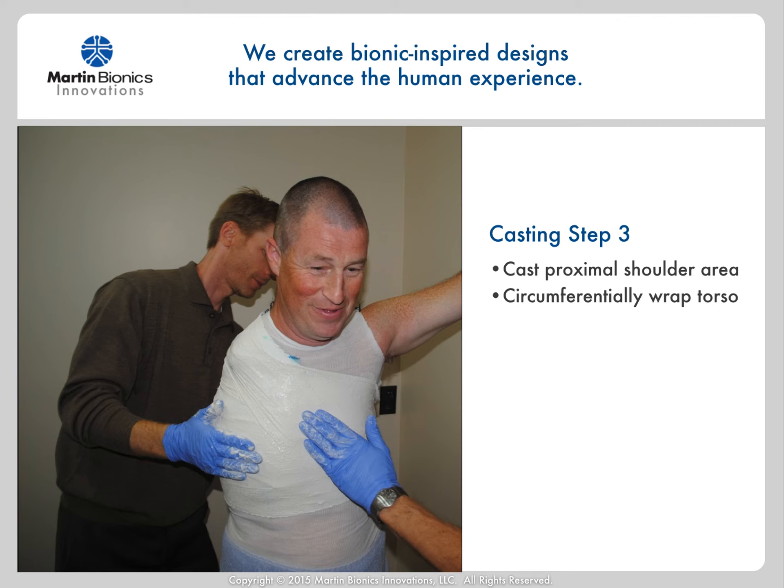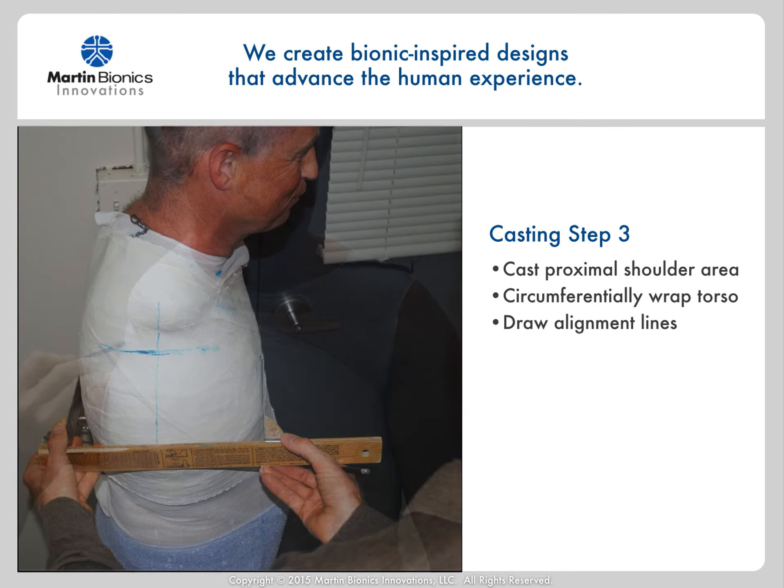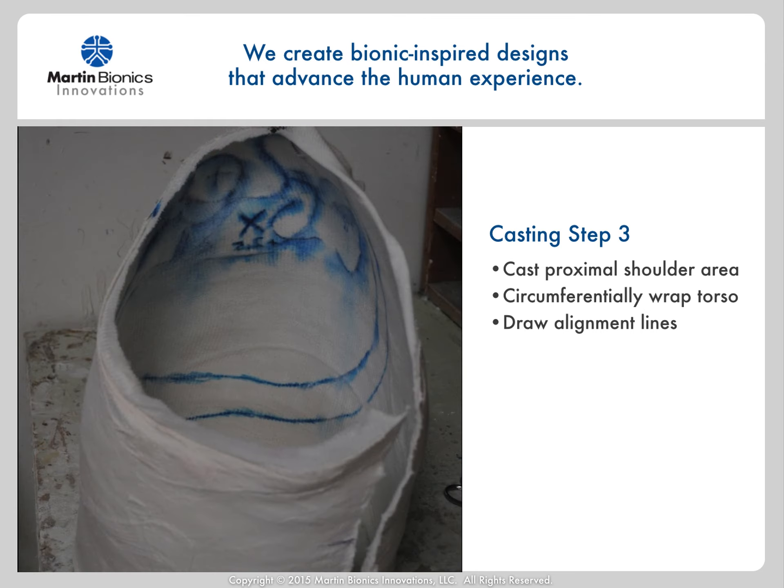Then circumferentially wrap the patient's torso with elastic plaster. Once the plaster is set up, go back and draw vertical and horizontal alignment lines so that you can pour the cast in the proper orientation. This will also help to modify the shoulder joint mounting area in the proper orientation. Make note of the AP dimension of the cast to make sure that it doesn't lose its shape when removing or pouring with plaster. You can go back and remark any landmarks inside the socket to make sure that they transfer onto the cast.